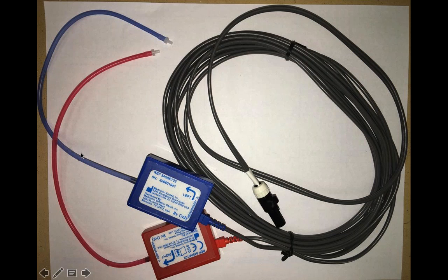And then we've got this plastic tubing, this little plastic insert at the end, which is probably the most critical piece. It is the cheapest piece and the one that you'll probably lose first. So just be aware when you're running these tests to keep an eye out for these little tiny plastic inserts, because if you lose them, you can't run the test.